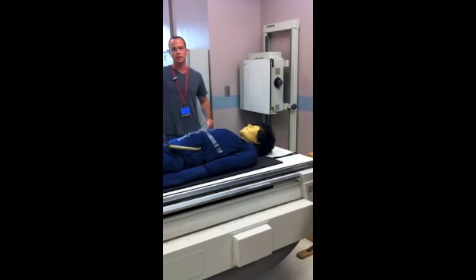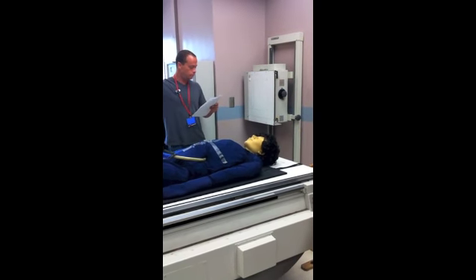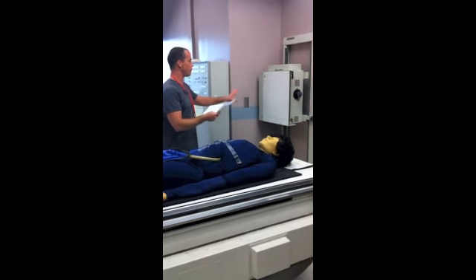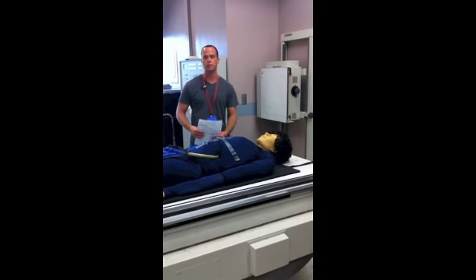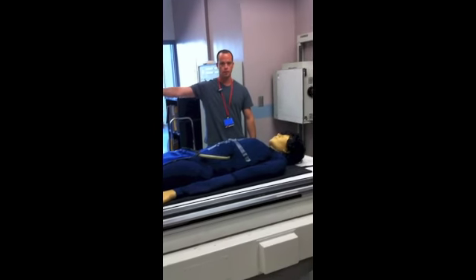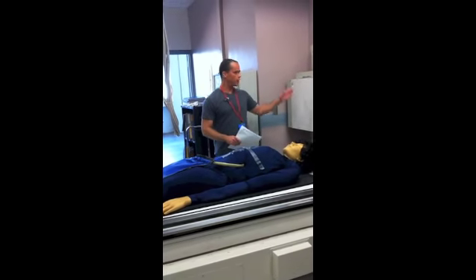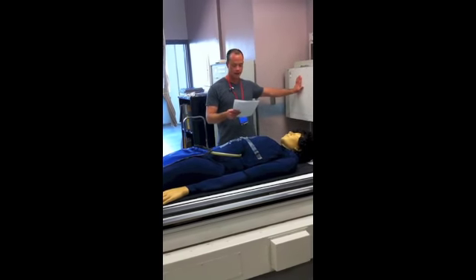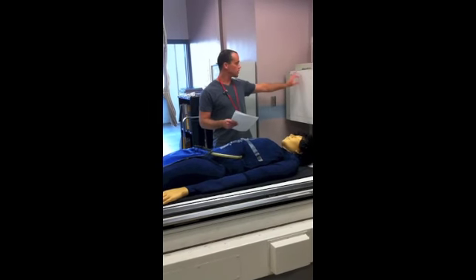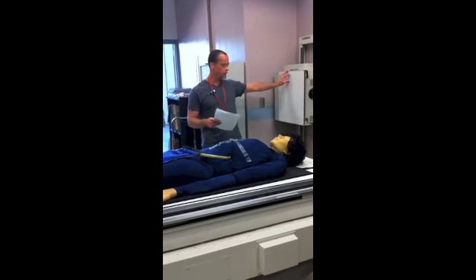The SID is still 72 inches. So now I'm going to have the patient move from this position to true lateral in reference to the tube. The patient will be facing that way in true lateral, left shoulder up against the IR. And same with the PA chest, same with the lat.